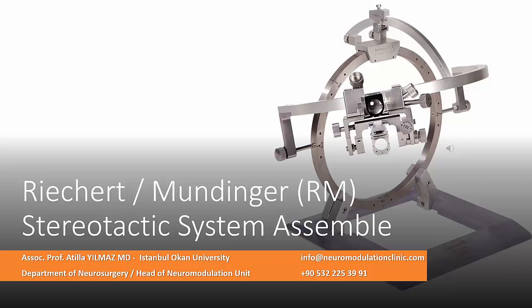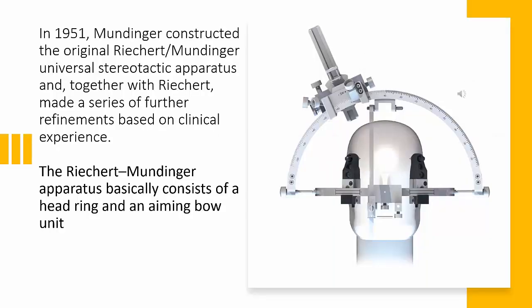Dear colleague, in this lecture you will find the assembly of the Richard Mundinger stereotactic system, also known as the RM stereotactic system. Before starting the assembly, I would like to give a brief introduction about the components of the frame.